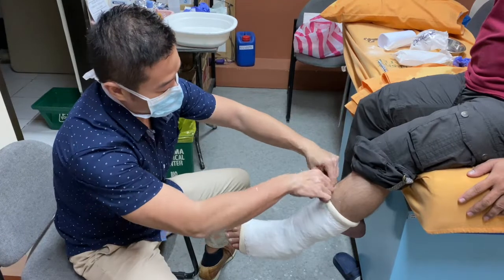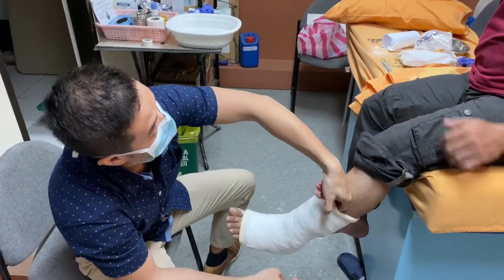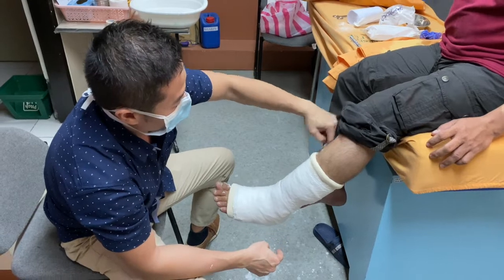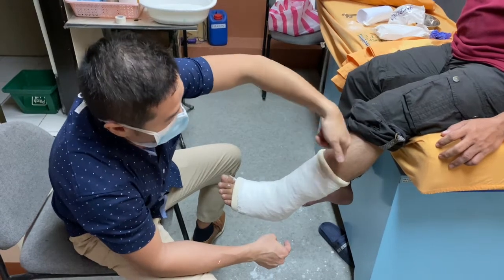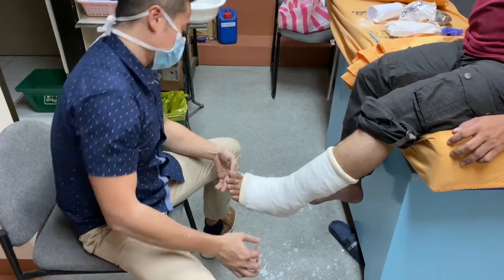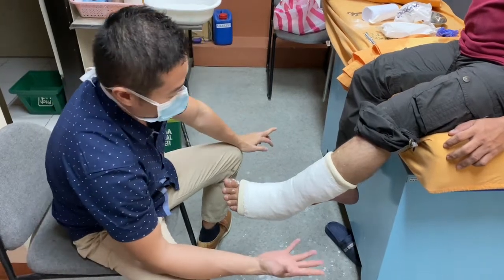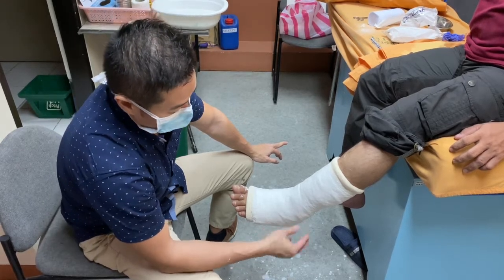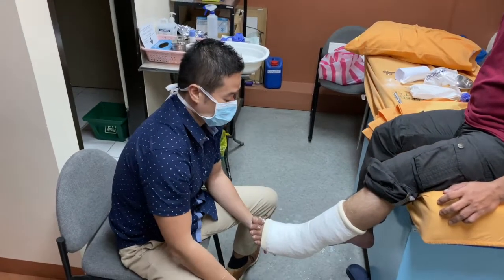Check the fit to see if it is too tight. You should be able to insert one finger — if you can insert one finger, that is adequate. If you cannot insert a finger, it is too tight; if you can insert the whole finger, it is too loose — only the thickness of a finger. Check the alignment as well. With plaster of paris, the patient cannot bear weight on this cast, unlike fiberglass types. The advice is mobilization and non-weight bearing to let the fracture heal.